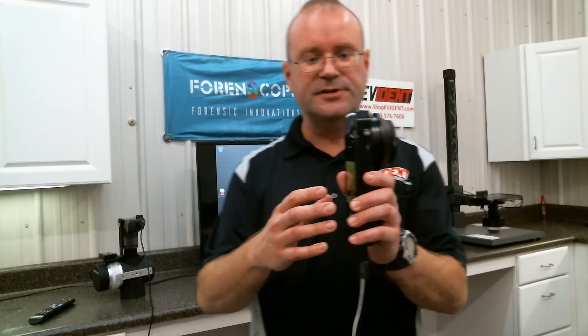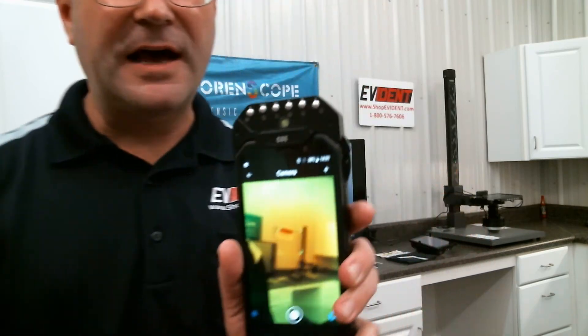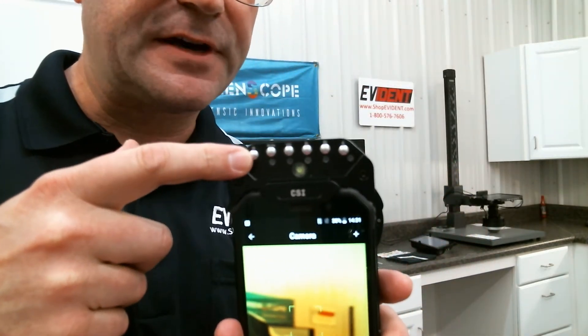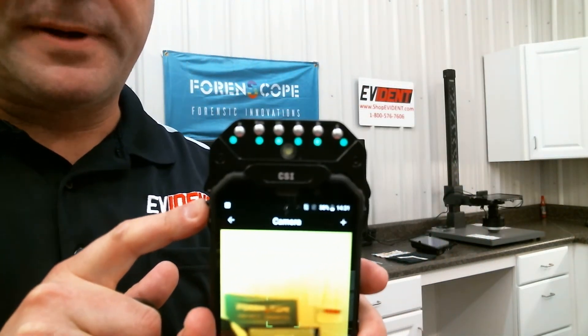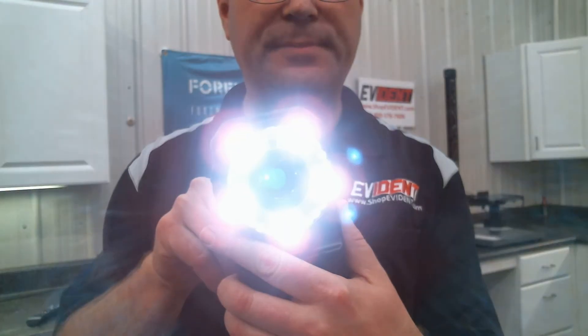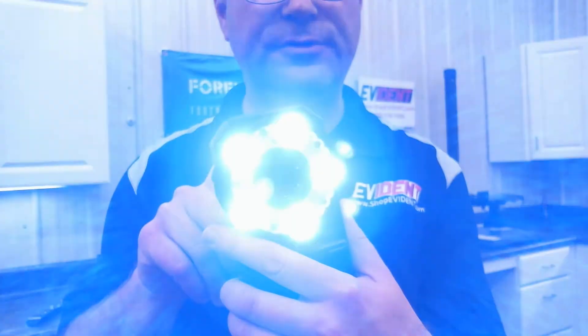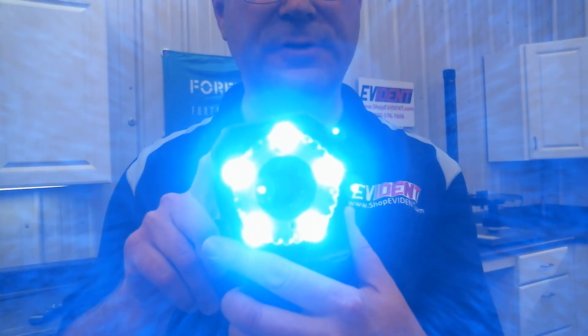Same construction with the metal housing, the external battery, the light source ring, the photo scale cap. It has a lot more light source settings on this device though. We've got white, white plus, UV, and this also has blue, blue 2, and green.